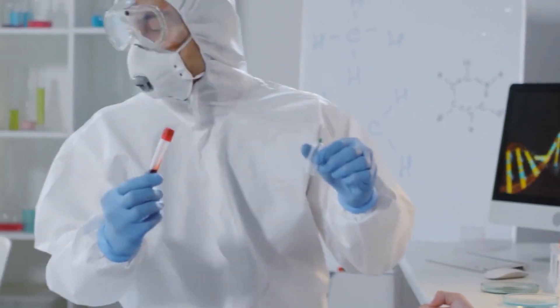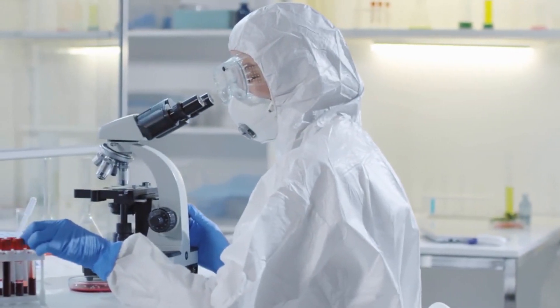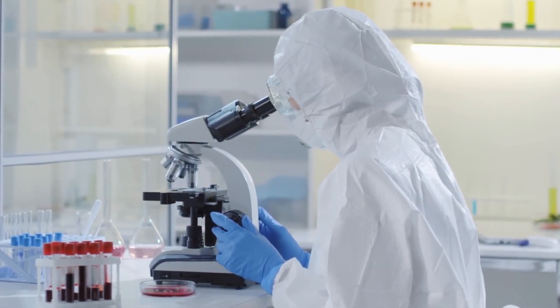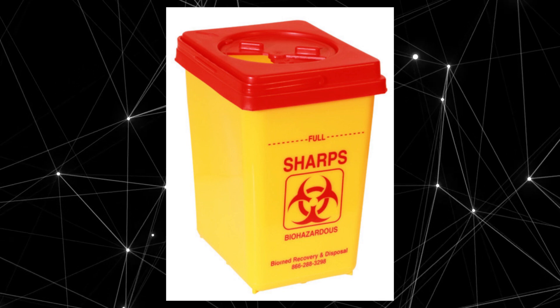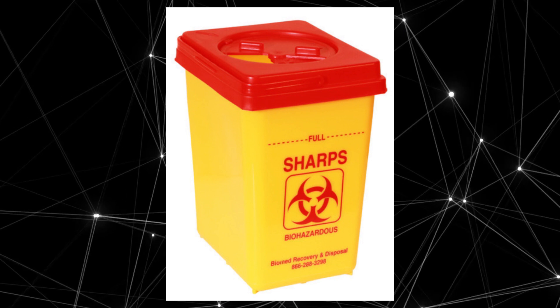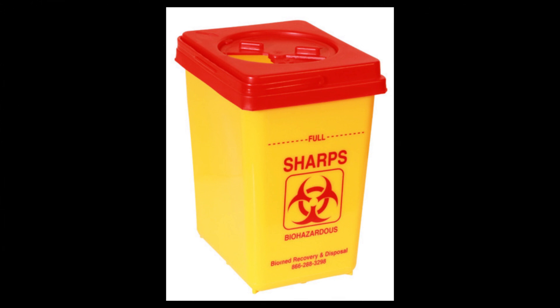Place a bandage on the participant's arm. Label all tubes with the pre-printed labels provided. Finally, the needle should be discarded into a sharps container, and place all labeled tubes in a cool box and discard waste into a biohazard container.